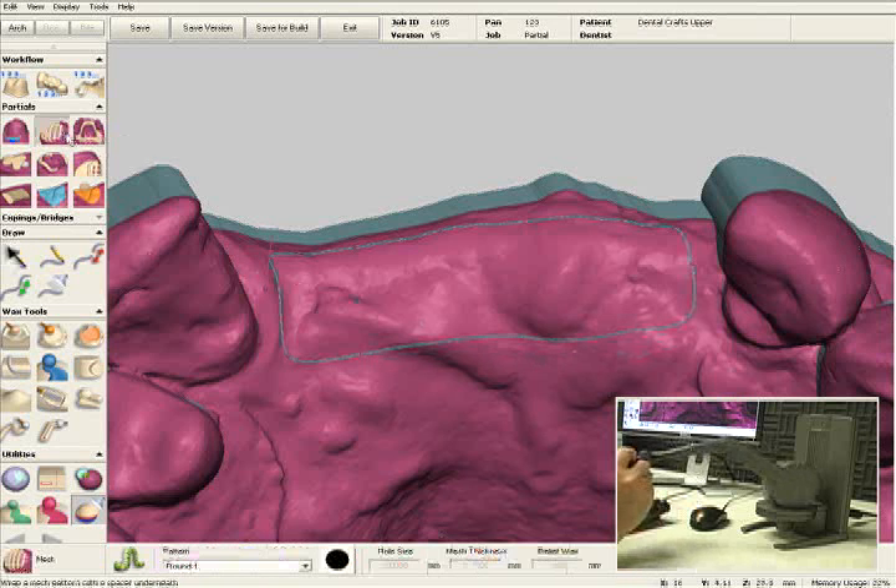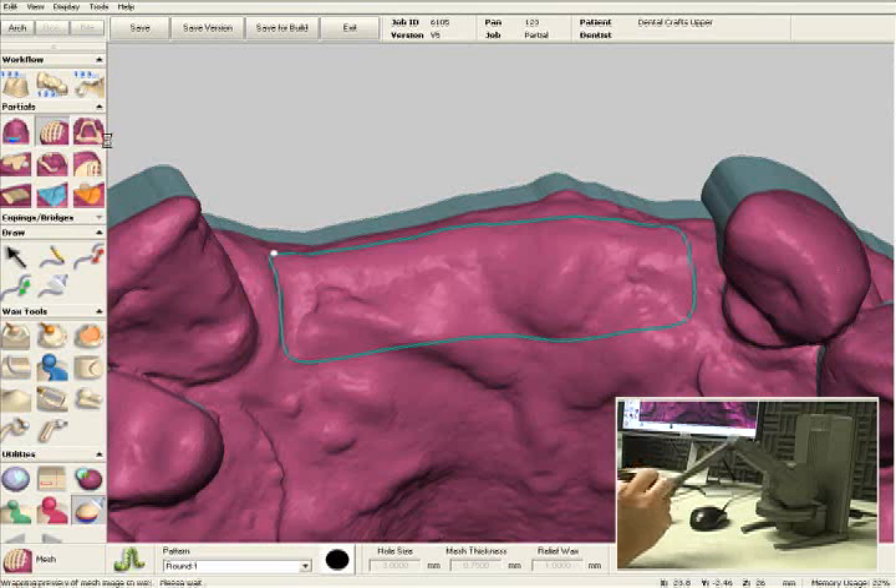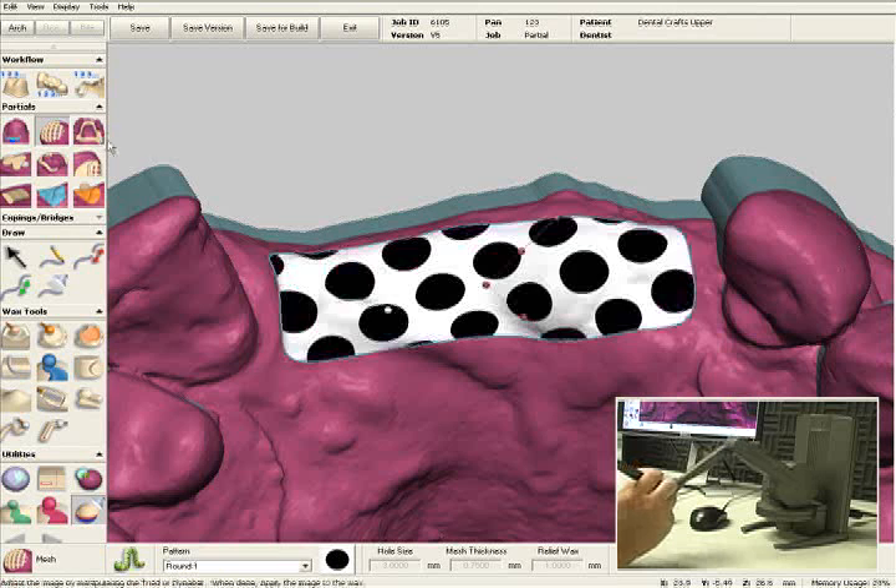Now I'm going to select the mesh tool and click on the outline. This will show us a two-dimensional preview of what our mesh is going to look like.